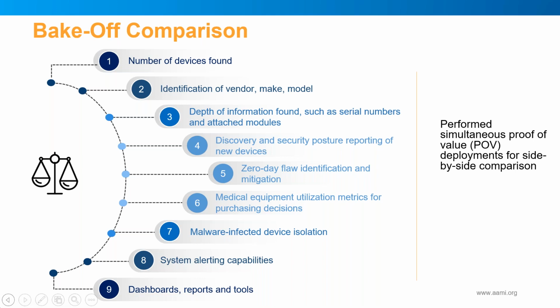Basically, there's a lot of functionality that we were looking for, and we were able to live a day in the life with it during this bake-off. We would have both systems stood up side by side on our computers, and several of us were in both systems at the same time to each get our own perspective of what was going on and what we were gathering. Some of the big features we were learning about was the ability of the systems to provide software revisions, OSs, and so on and so forth.